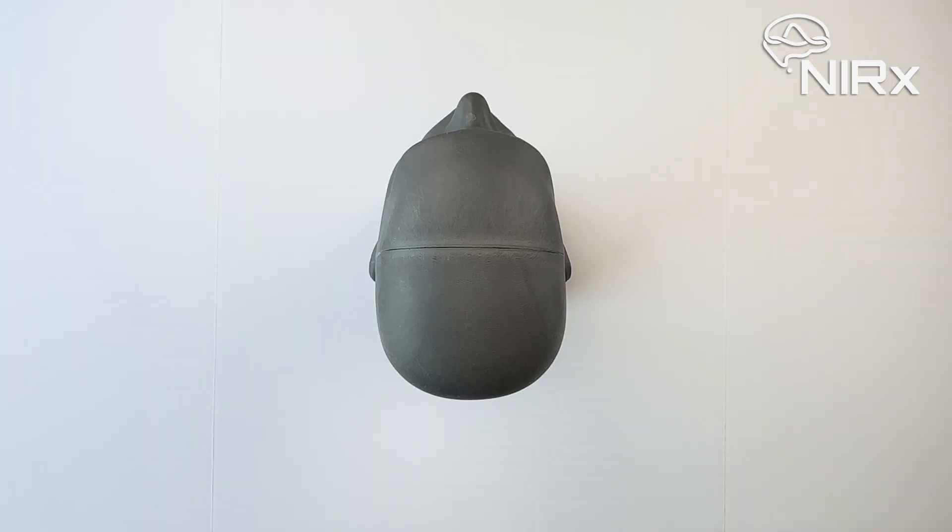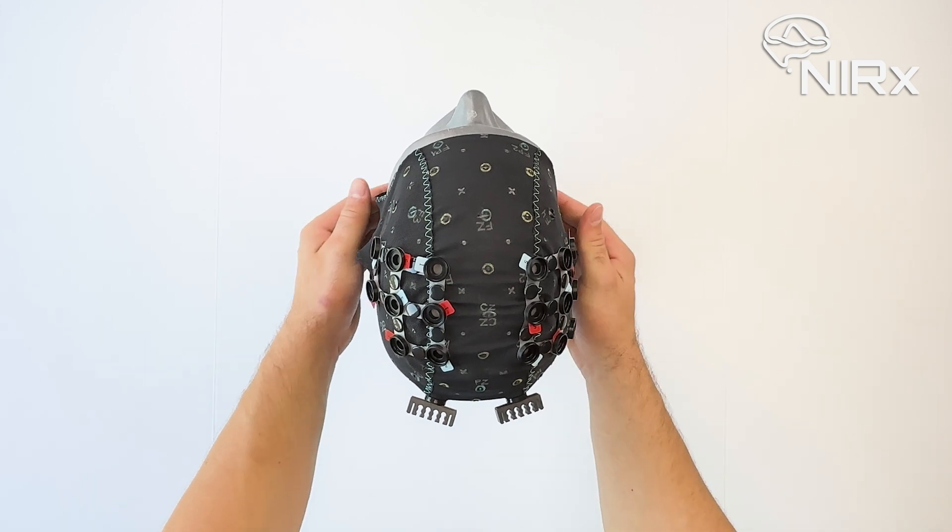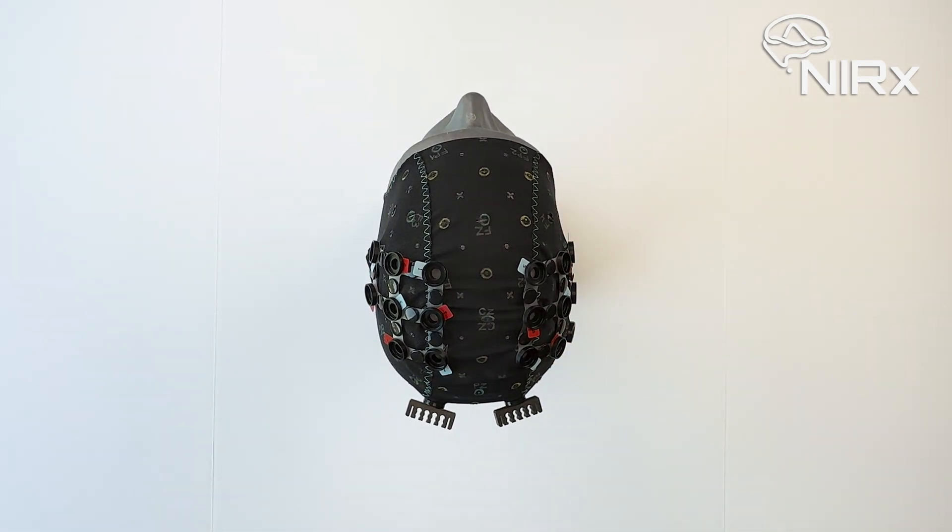Now, to begin populating, start by placing your cap on a mannequin head. Note that the cap should be pre-assembled according to your specific montage. This includes the placement of grommets and labels in the correct location, as well as any short distance detectors and cable trees.